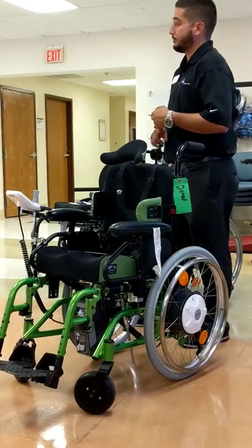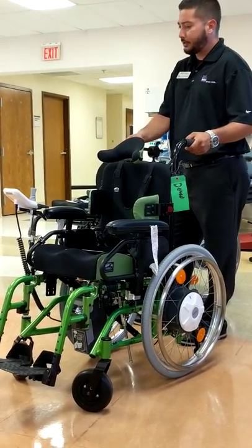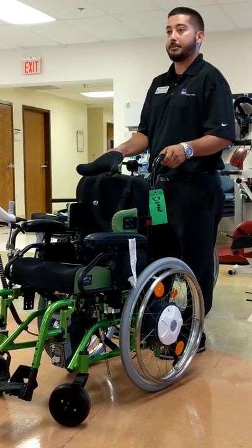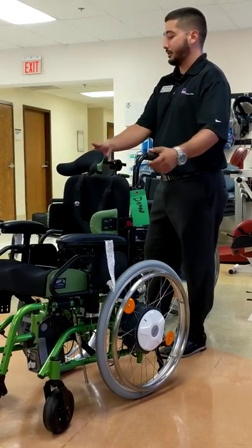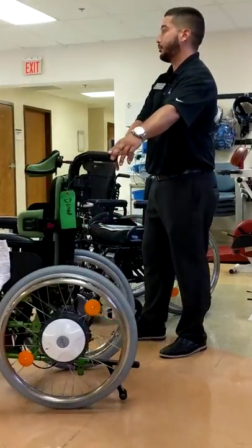Depending on where you want that joystick mounted, maybe it's an attendant control — we can mount it on the back. We have dedicated attendant controls that we can put on it as well. They're sensor-driven, so there would be handles on the back side of the chair. As far as getting the chair to go forward or backwards, you're just pushing on a lever on the bottom of that handle. To get the chair to turn, it's sensor-driven — you give a little bit of pressure on that handle and the chair turns for you.